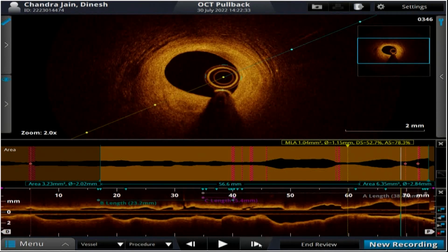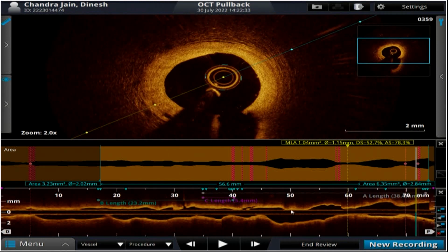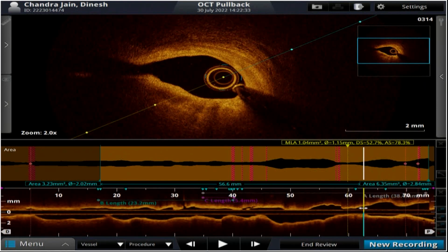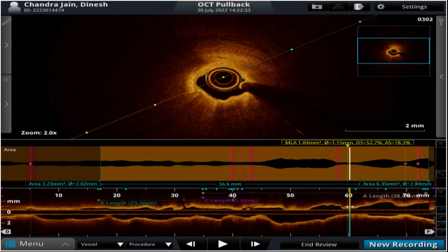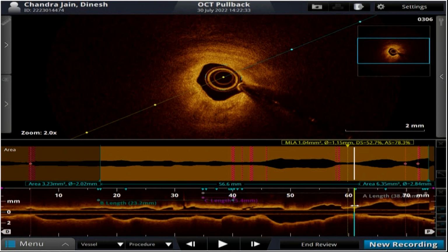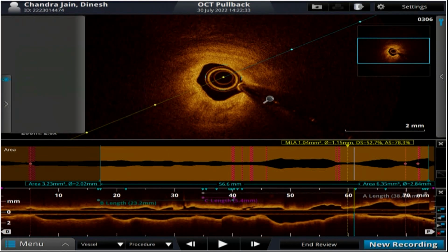So do you do OCT in all these patients, even if you have a creatinine of 2 point something? I think it's 2.4 or 2.3, and so you could have used. The point of the case was that we are doing OCT without contrast. I understand. This is saline. No, I understand that. Your first one, because of co-registration, you had to use a little contrast, and you must have mixed it with saline.